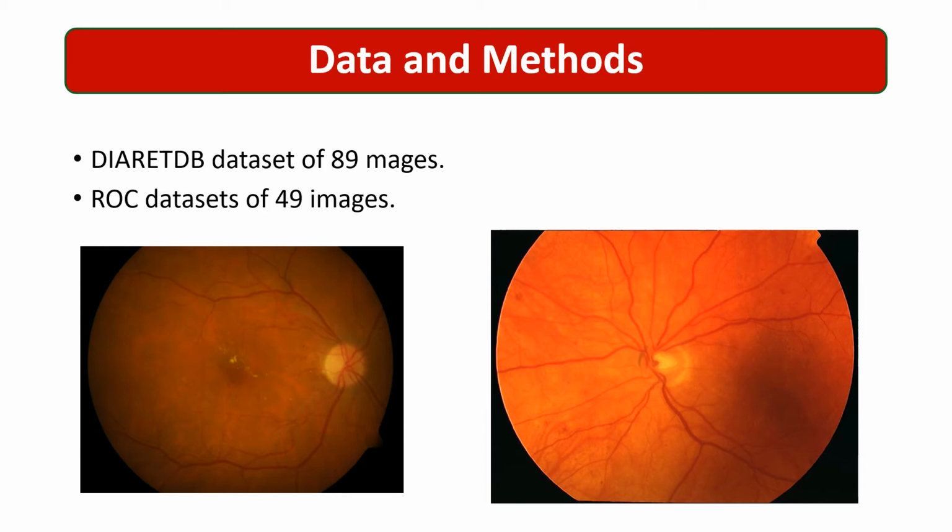These are fundus photos from both datasets. In each picture, there are some microaneurysm signs, but they are hard for us to see, especially if we are not eye doctors.